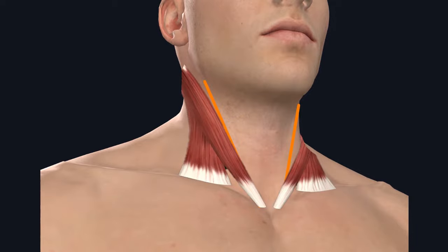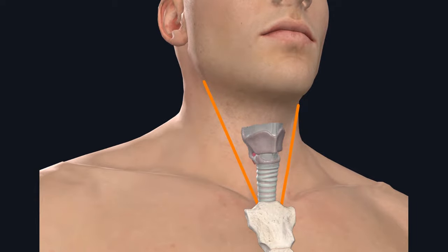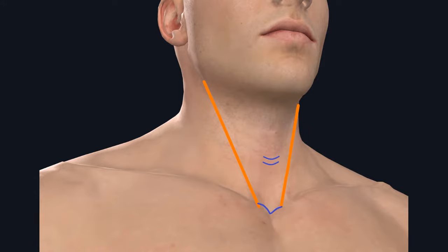Orange lines mark the medial end of the sternocleidomastoid muscle. We'll palpate for the sternal notch and the cricoid, which helps identify the second and third tracheal rings where you'll be aiming for the tracheal opening. For a planned tracheostomy, we'll be making a horizontal incision located medial to the sternocleidomastoid muscle. For an emergent trach, you'll use a vertical incision, which will help you identify different levels of the trachea more easily.